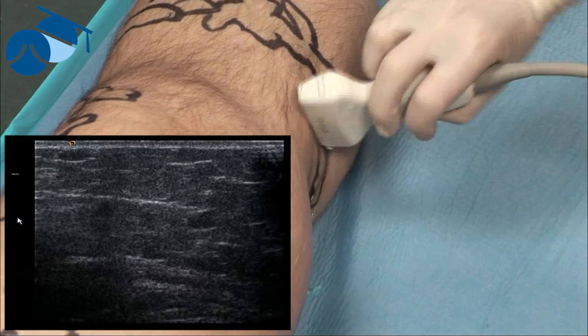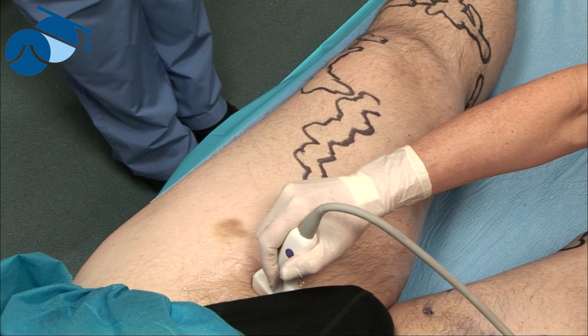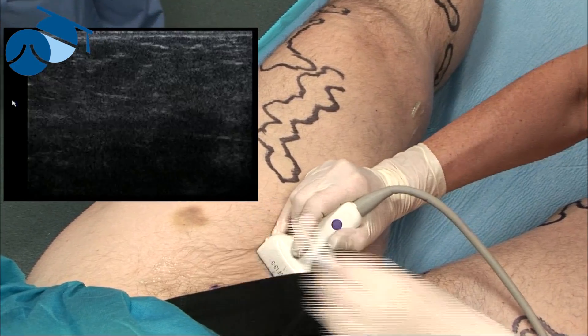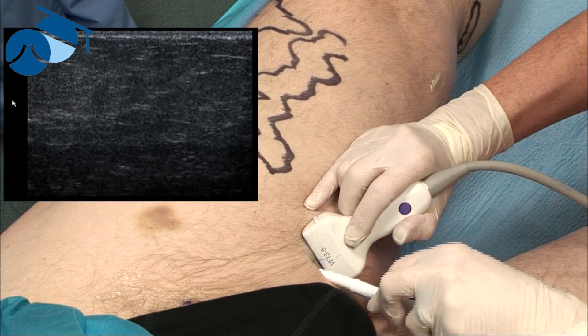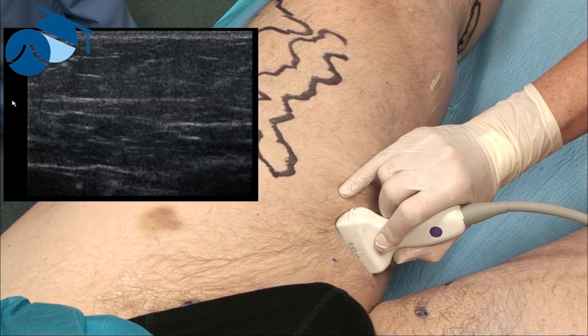So now we're going to mark the vein. We're happy that it looks fairly good all the way down and we've chosen the entry site below the knee on this side. We find the sapheno-femoral junction here and mark that, then the anterior accessory saphenous vein going off laterally, which we'll come back to. We follow the great saphenous vein down — it's still within the saphenous fascia, so we know it's in the position where we want to put tumescence. It's completely patent.